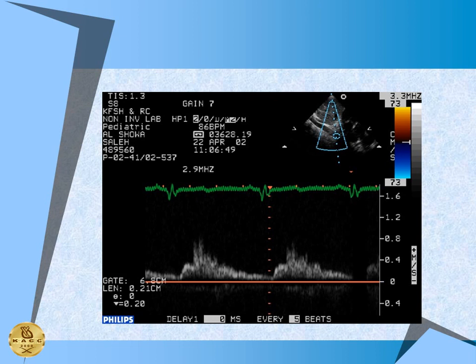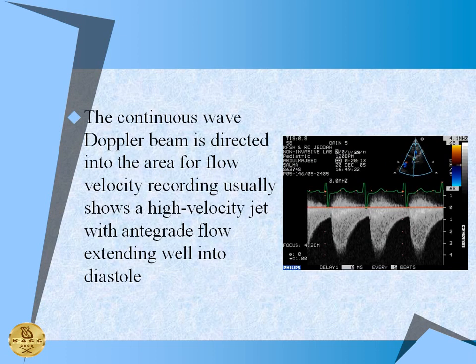This is what you get in the abdominal aorta in a coarctation by Doppler. See how damp the flow is? It should be nicely pulsatile, more than 0.8. This is hardly a 0.4. And you see the forward flow in diastole, because the pressure in the ascending aorta remains high in diastole. You still get flow throughout diastole, and it's not the usual negative blip that we see in the usual abdominal Doppler because of the cerebral flow.